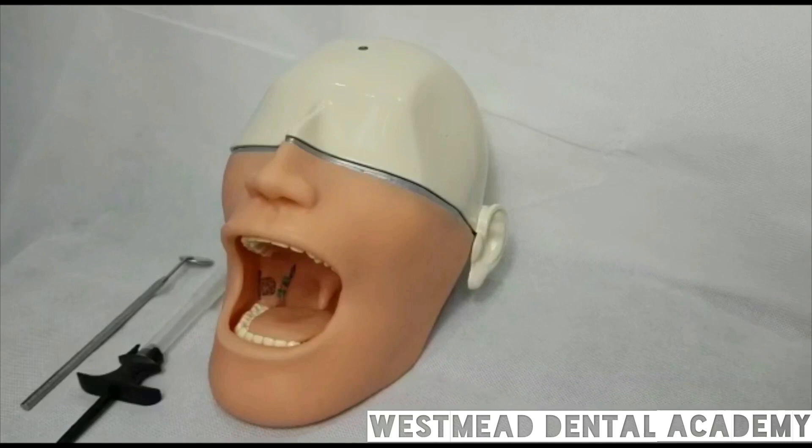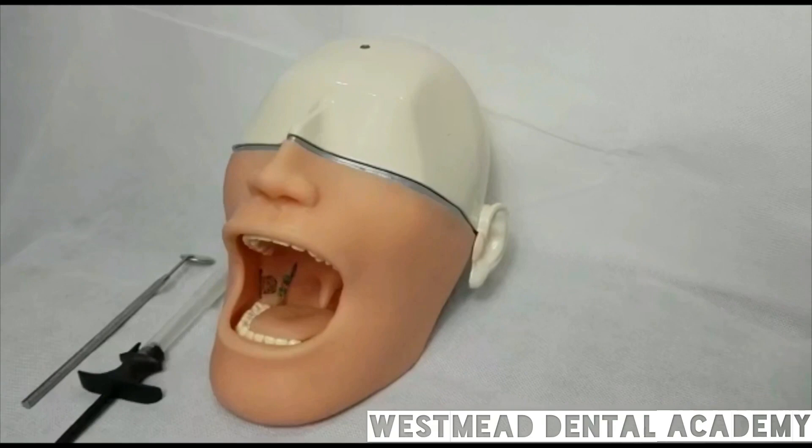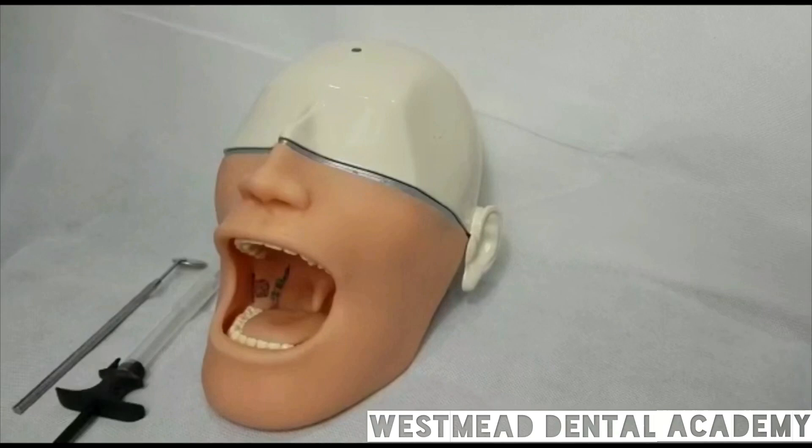I believe that this video will be a great help because of two reasons. Number one, this mannequin is not widely available in Australia, and you may find it only in a few venues, such as Sydney Uni. And the second reason is because I have found that this mannequin is a bit tricky — because there is a little bit of a difference between the anatomical landmarks of the patient's mouth and this mannequin.